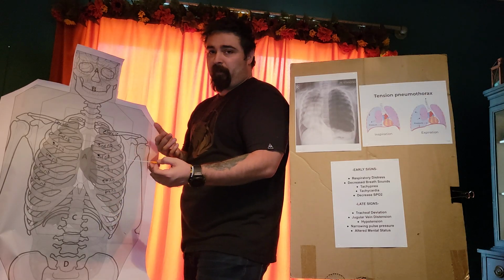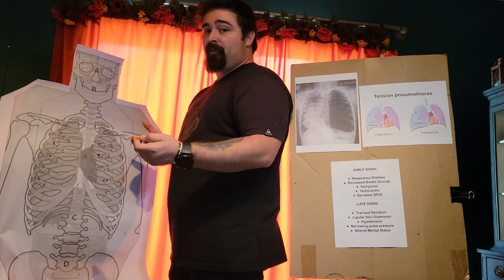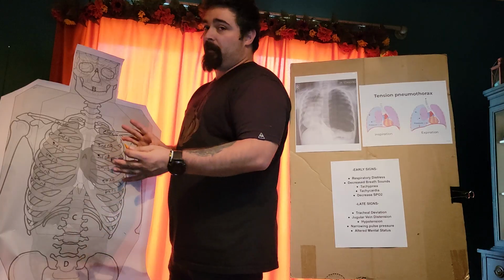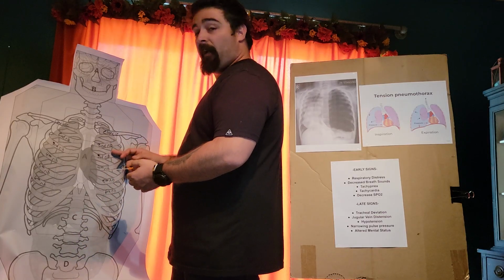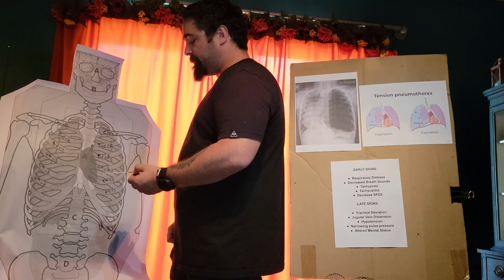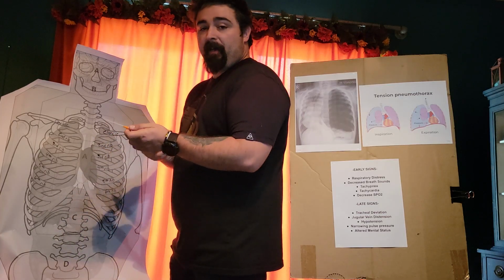If they have any returning symptoms, respiratory distress and stuff like that, the returning of the indications that you performed the NCD for, you can retrieve it and use it again on the same patient. We're not using it on multiple patients. Use it again on the same patient, either at or just around whichever site it is that you used. And then, of course, assessment and reassessing of the patient.